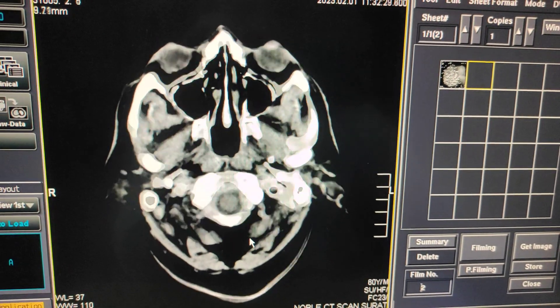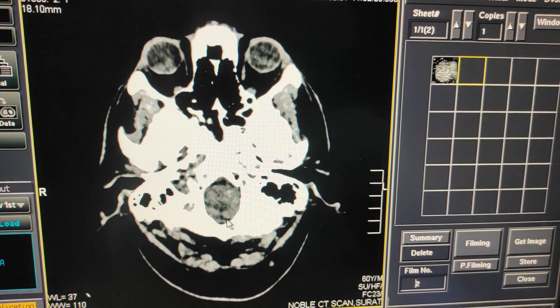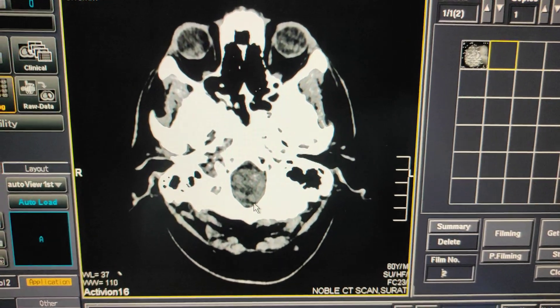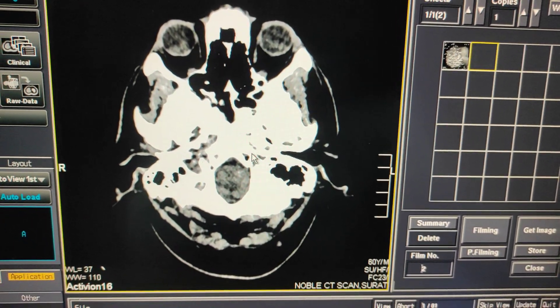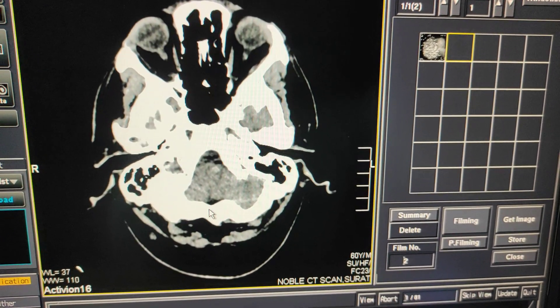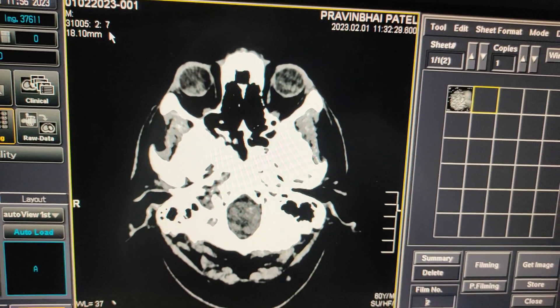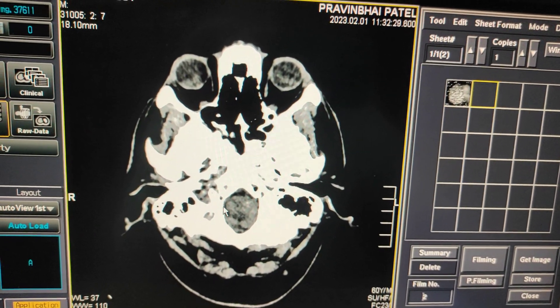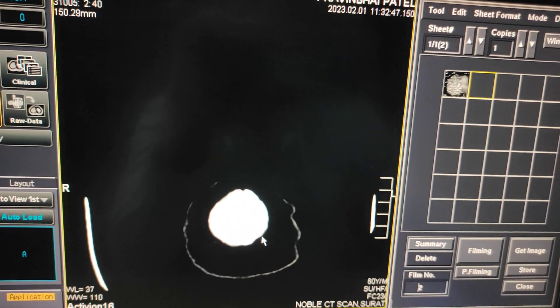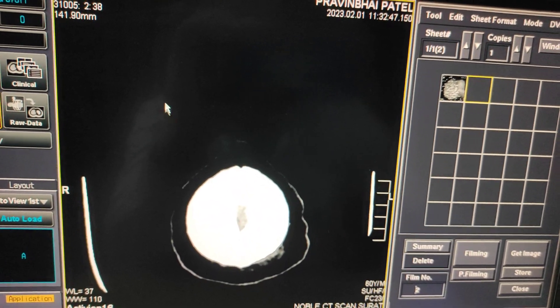These lower images are not useful. If the patient has a tumor there, then you have to include that image. But right now this patient has a complaint of head injury, so this image is not useful. You can see image number 7 is over here. From 40 images, 7 images are already minus, and these images are also not useful — so from the remaining 38 images my film will be accurate.